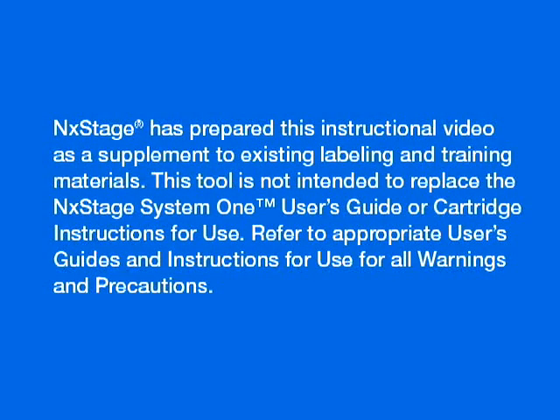NxStage has prepared this instructional video as a supplement to existing labeling and training materials. This tool is not intended to replace the NxStage System 1 User's Guide or cartridge instructions for use. Refer to the appropriate user's guides and instructions for use for all warnings and precautions.